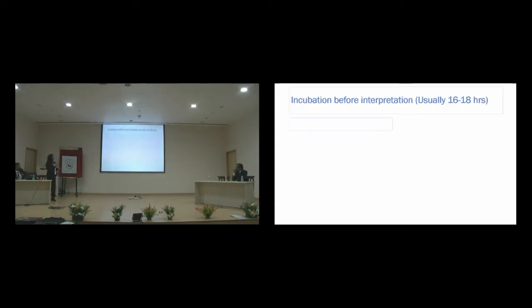So next is the duration of incubation. For most cultures, before taking the reading, the duration of incubation is 16 to 18 hours. There are certain conditions for AST where the full 24 hours of incubation is mandatory. Can any of you point out a few examples? Yeah, vancomycin for enterococci. There are other examples.